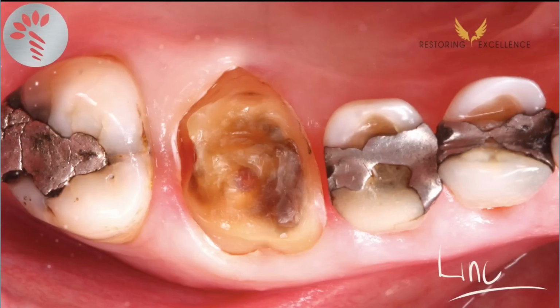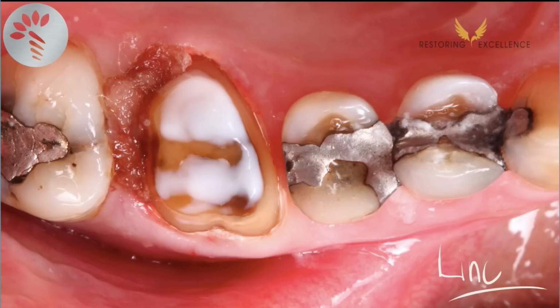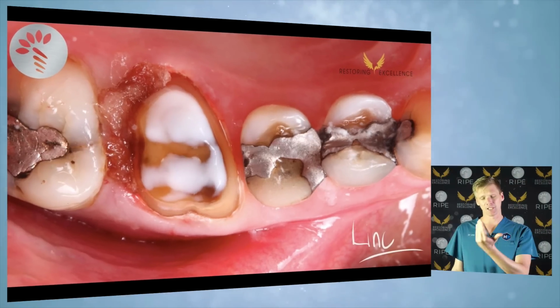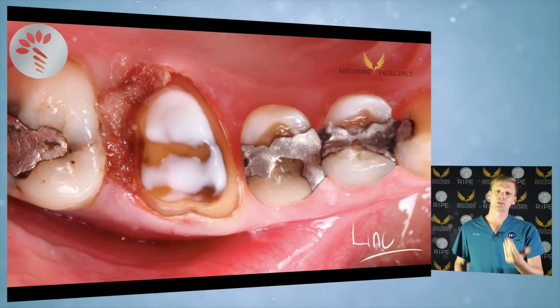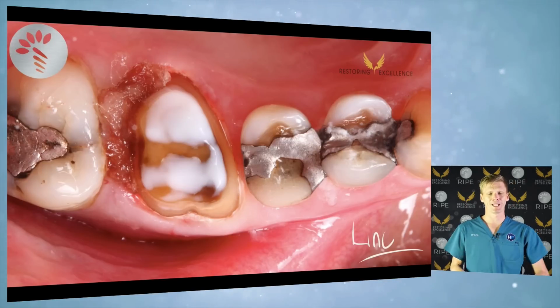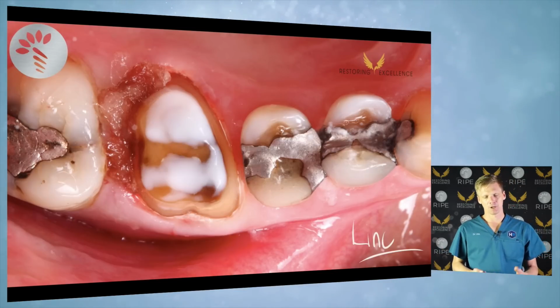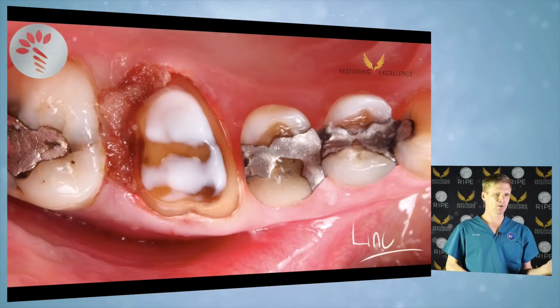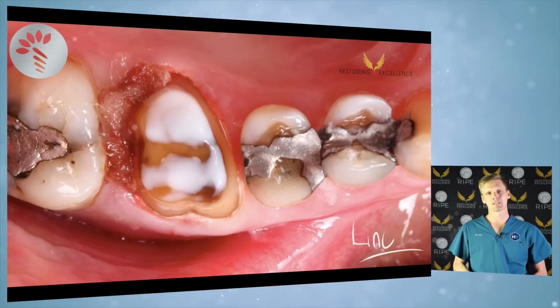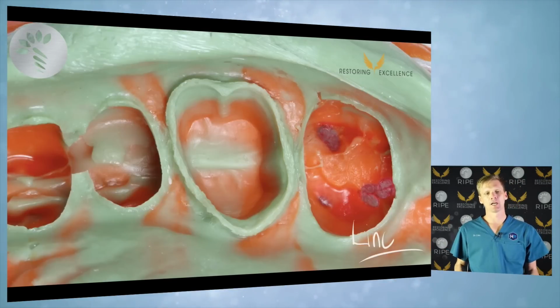So in this case, there's my big blob of composite. Okay, now when I prepped, now we have bleeding again. It's prepped with a chamfer, so the outside edge of the burr is going to hit the tissue a little bit. Try and do the bit close to the tissue with a finer burr if you can, but you can't always. Sometimes you have to use your coarse burr and it's going to bleed. So you can see once again, I've got the cotton soaked in Viscostat, pushed in there. We wait 5 or 10 minutes and then it's like this. Easy to take a perfect impression, bang. First go, and there's the die.